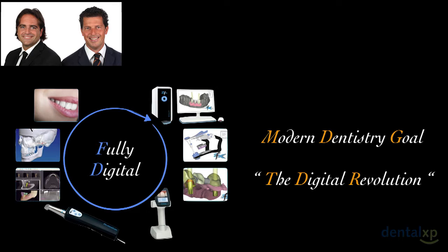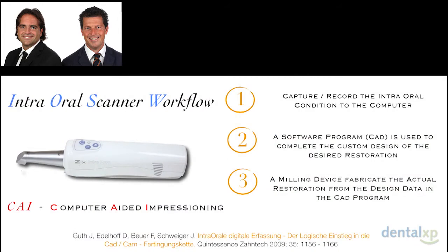So, what is important to understand is what is the goal of this modern dentistry? What is the goal of this digital revolution that is happening in the last years? The goal is to try to close this circle, trying to become completely digital. And in order to do this, in the last few years, several technological tools have been developed, such as the intraoral scanner, which has a specific workflow divided in 3 main points.